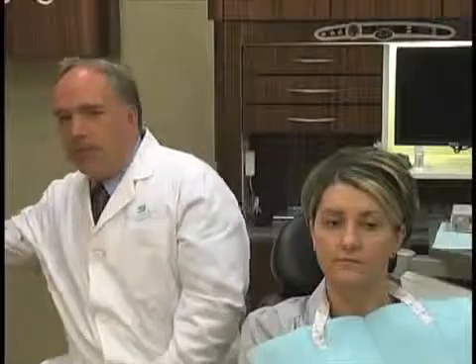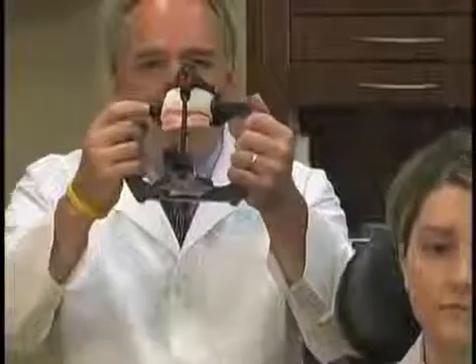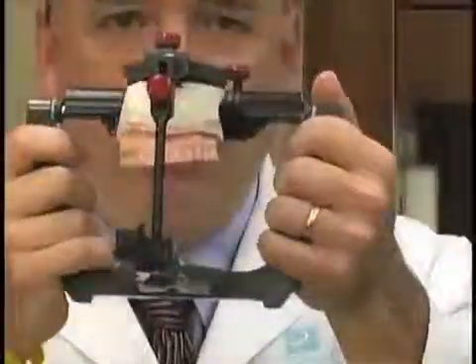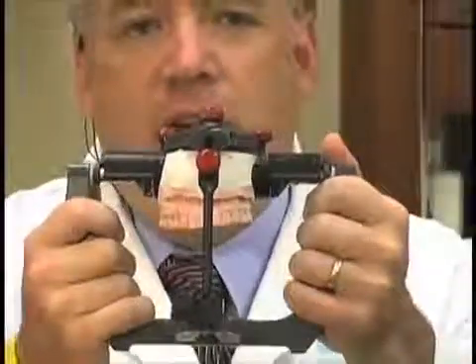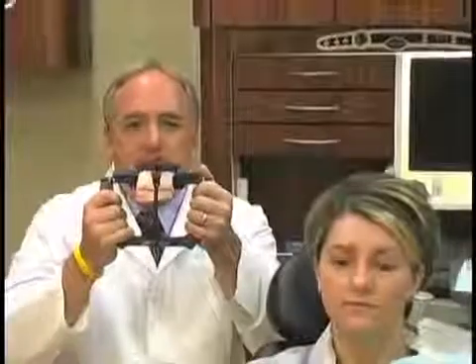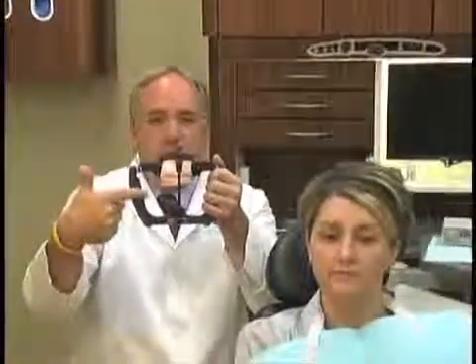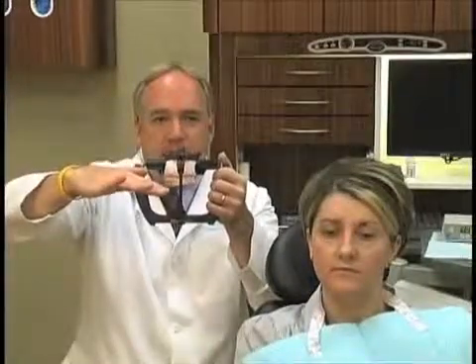This is a really nice example of a patient that we're doing on Monday. You look at this guy's maxillary occlusal plane, and there is an absolutely tremendous cant to it. Now, in the photographic section, I'm going to show you a photograph we take to make sure that if we see a cant like this, it actually exists in the patient. We call it our Facebow verification photograph, and I'll go over that with you in another segment. But the point here is this patient is having this work done to correct it. Since this maxillary cast is mounted properly, when I put the provisionals in the patient's head, he's going to be level. And that, to me, is one of the most important things.